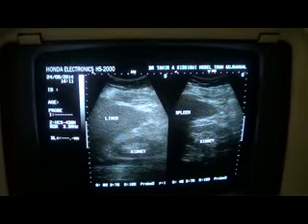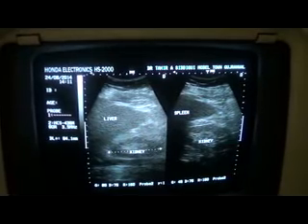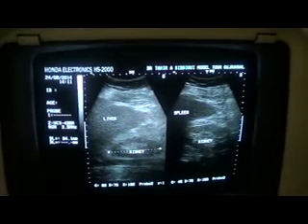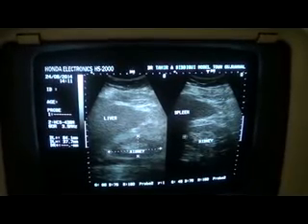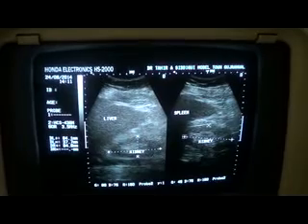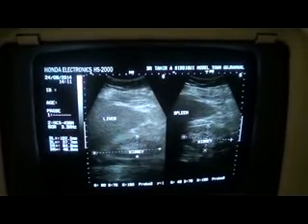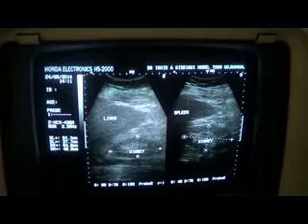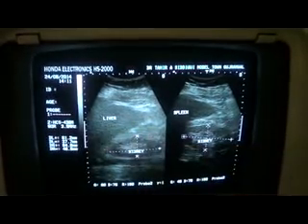Measurements. Are we in the normal range? You can see the measurements in this region.